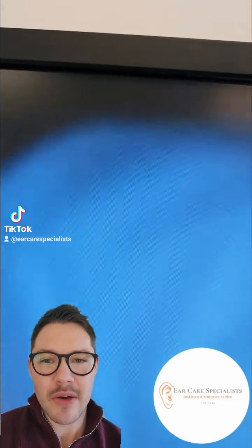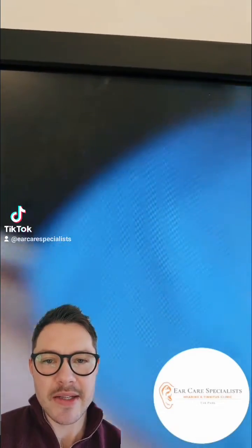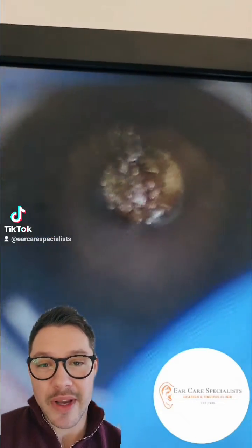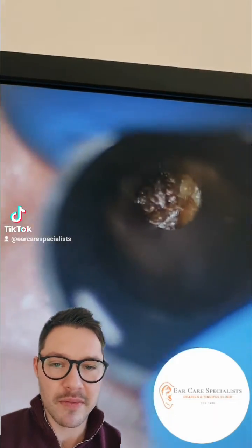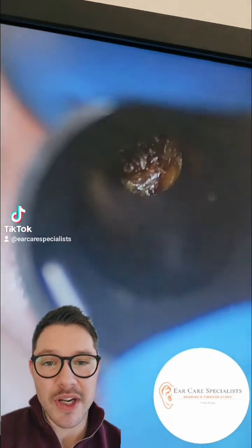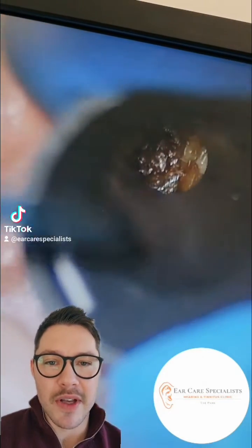I'm using an ENT operating microscope to visualize down these patients' ears. I'm projecting that video onto a screen after I've seen the patient and then I'm just videoing it from my phone, so I can actually improve the quality of these videos. The images are far better than this as I look.